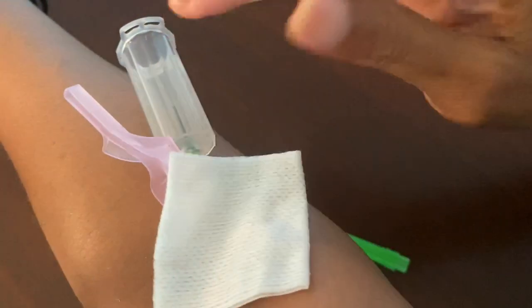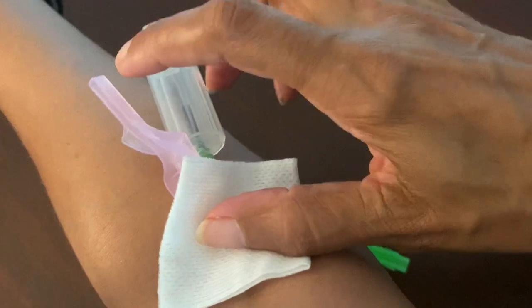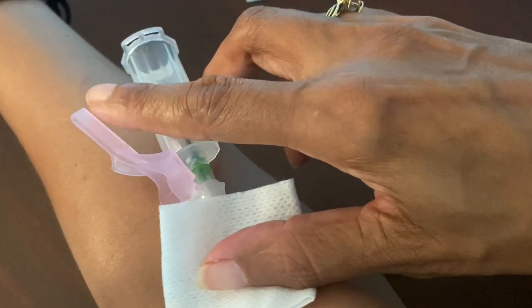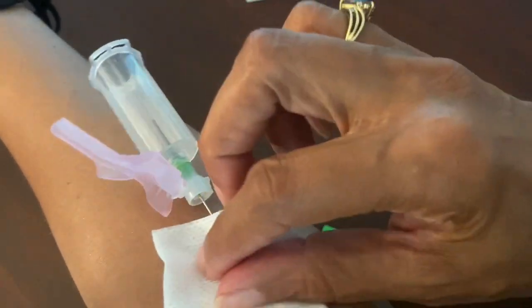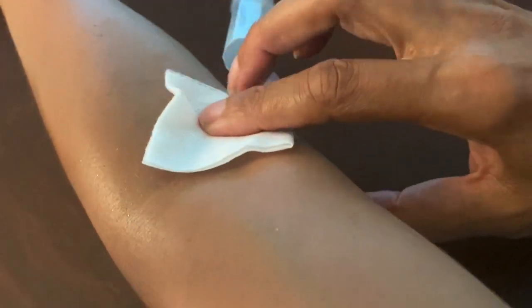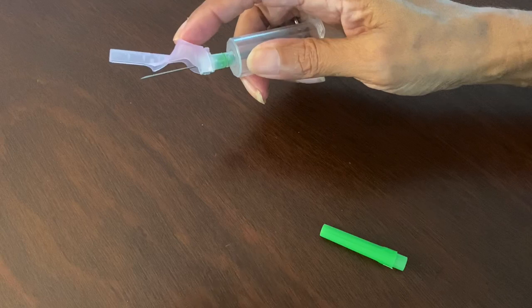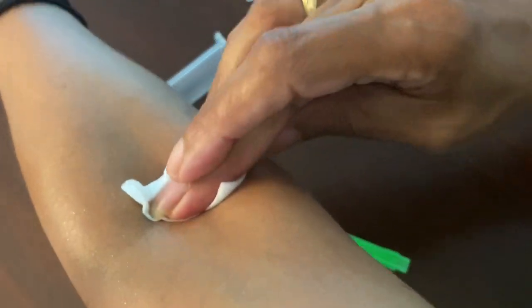Always allow your tubes to fill up on their own. For the butterfly — if you don't want blood to splatter, place your gauze over the site before you remove the needle. You can take the needle out or click it while it's in the vein, then pull it out and click it once it's out. And yes, this is just one of many ways to do a successful stick without having to fish around. Perfect stick — doesn't look like I stuck myself at all.